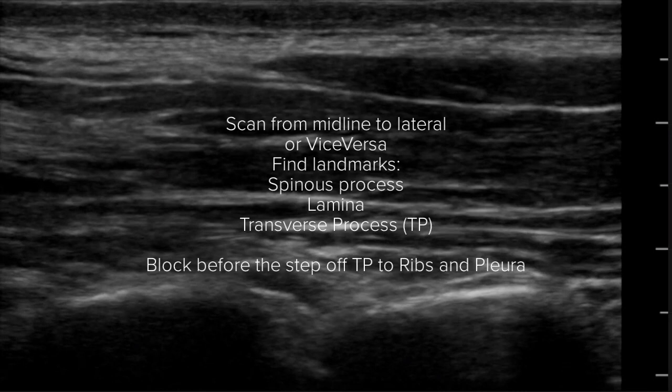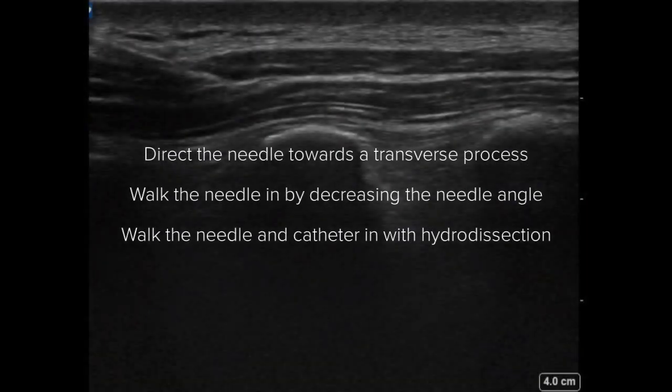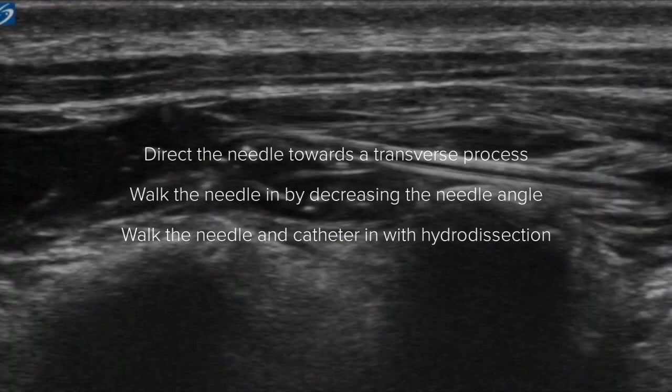Scan from midline to lateral or vice versa. Find your landmarks and block before the step-off of the transverse process to the ribs and pleural. Direct the needle towards the transverse process. Walk the needle in by decreasing the needle angle, and walk the needle and catheter in with hydrodissection.